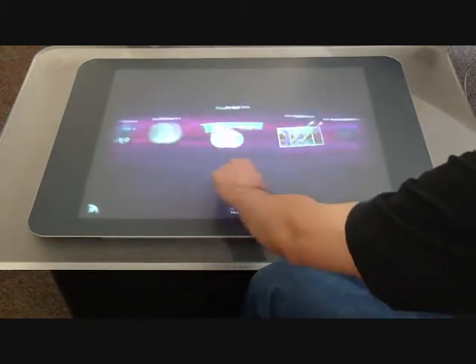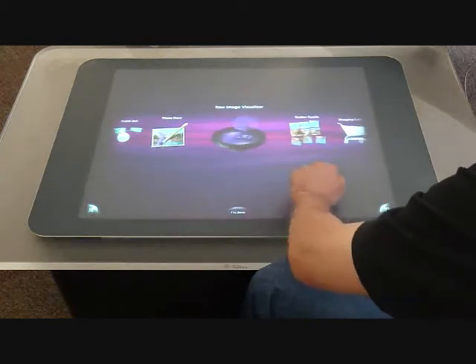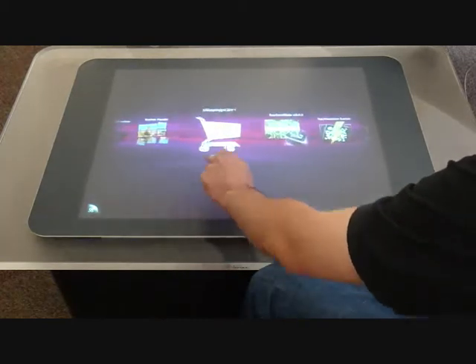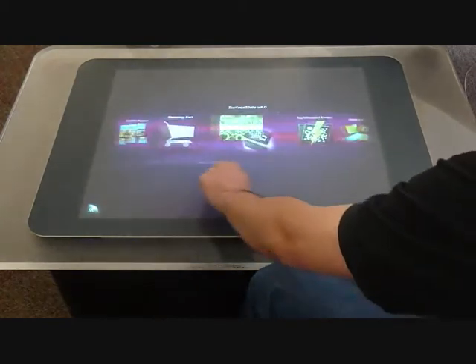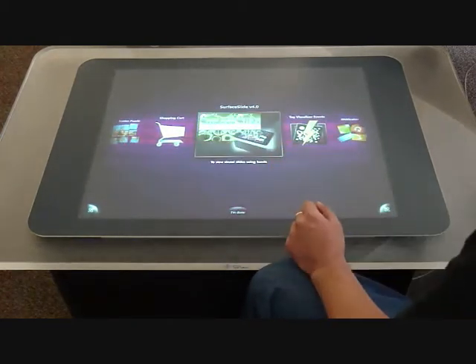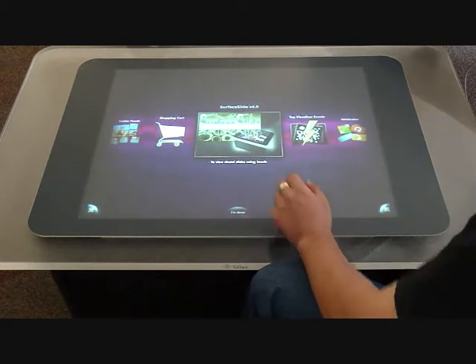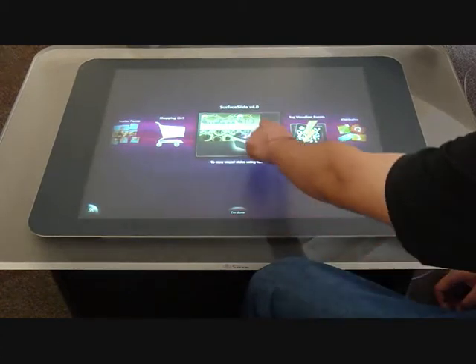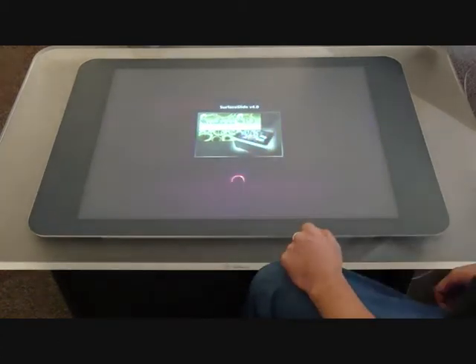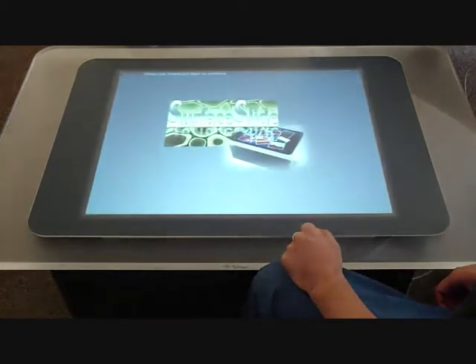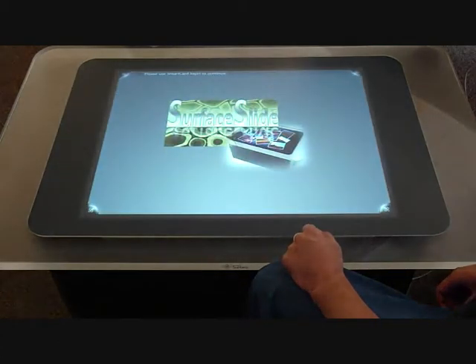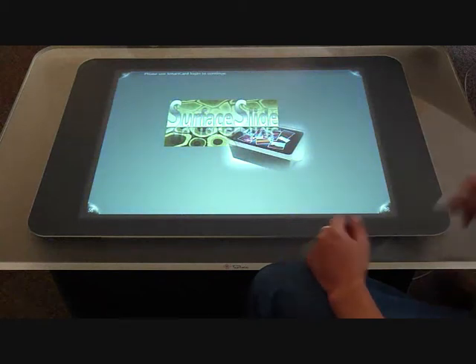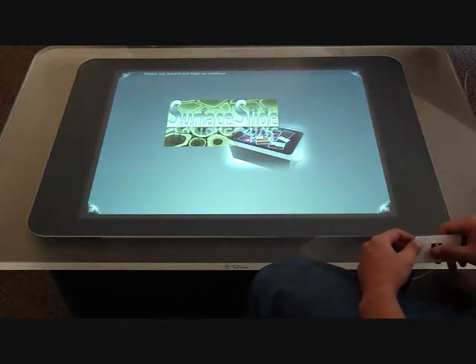If we go through these applications, we will see Surface Slide, which is the application we developed. If we click it, it brings you to the main user interface of Surface Slide.